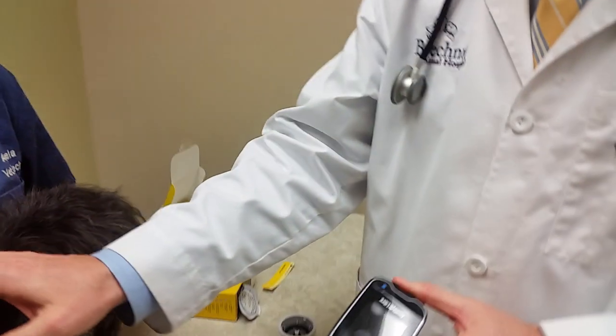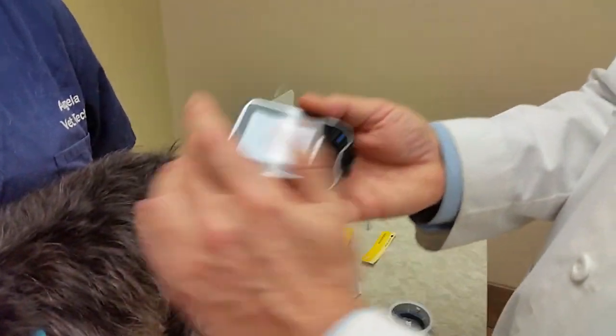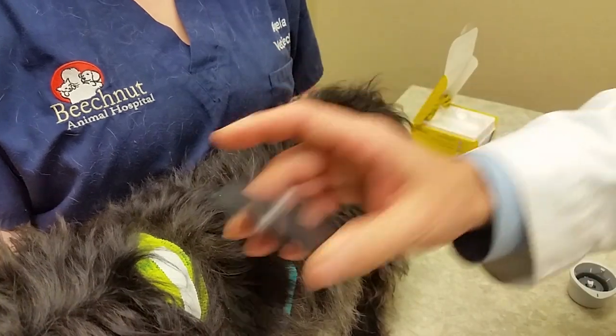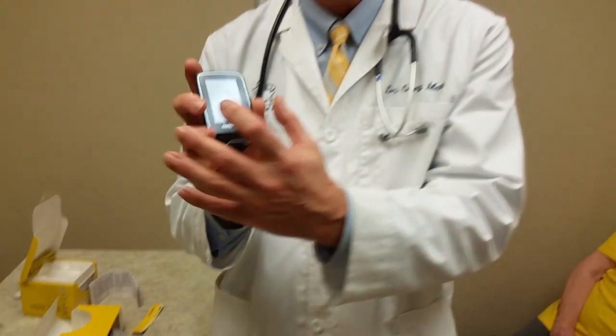Now I'm going to show you how to get a reading. Assuming the disc had been in for the 12-hour period, you simply push the button, it starts up, and you just run it over the reader and get your number — it would say something like 102 or whatever the glucose level is. There was a study in Italy showing that it is safe and that the numbers correlate well with in-house glucose testing. That's pretty much how the FreeStyle Libre continuous glucose monitors work in dogs.